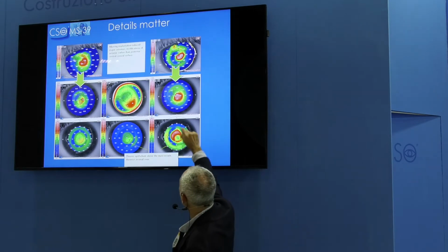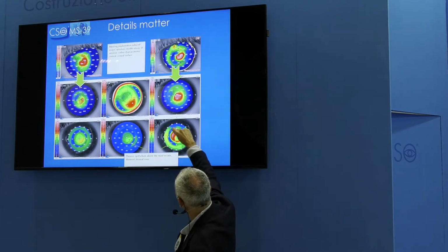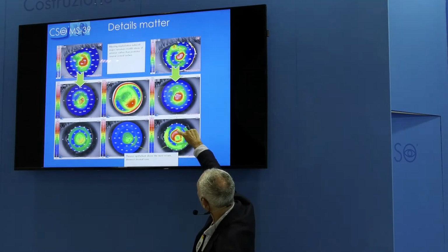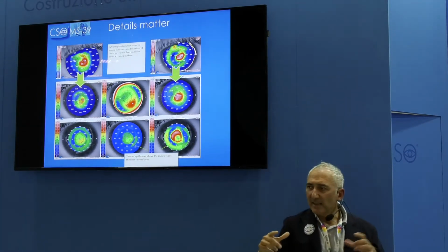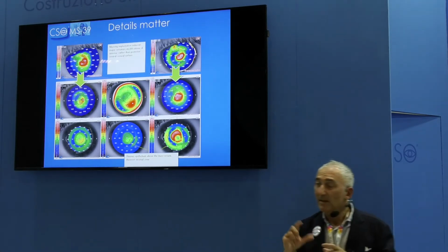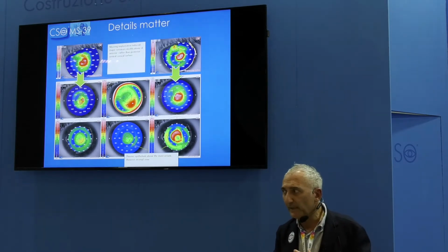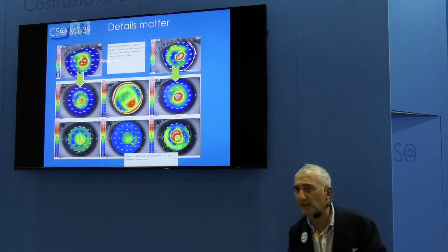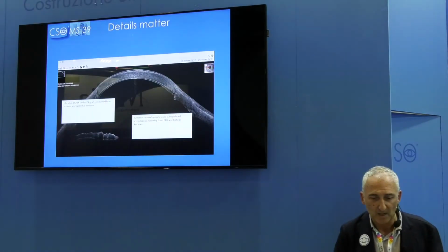And while on the other, the epithelial, this is the old thickness, the epithelium is much thicker, of course, in this area. And as these things happen inside the circular ring, they both cooperate in improving the curvature of the eye. So it's a very effective and very little invasive treatment.